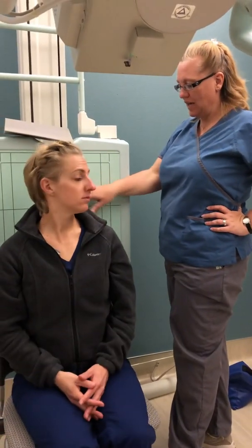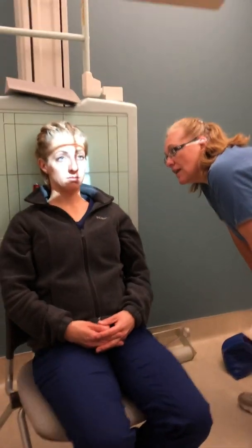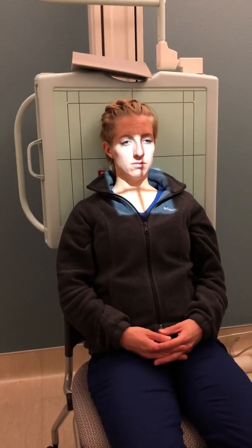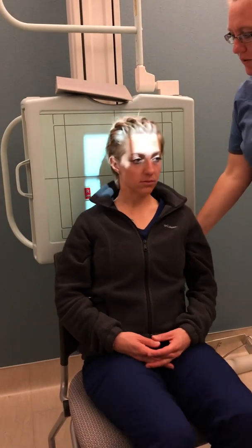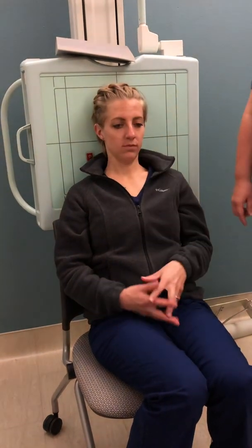Is this the one where we can also do 37 degrees if they cannot get into position? Correct. If they can't angle the chin down, then you increase to 37 degrees. So if you're starting at 90 degrees upright, or 0 degrees on the table, you just go 30 or 37.